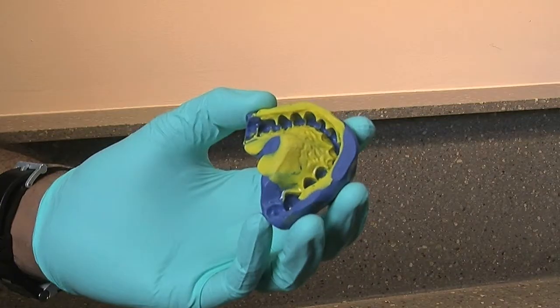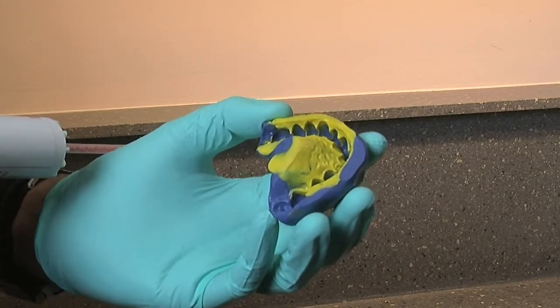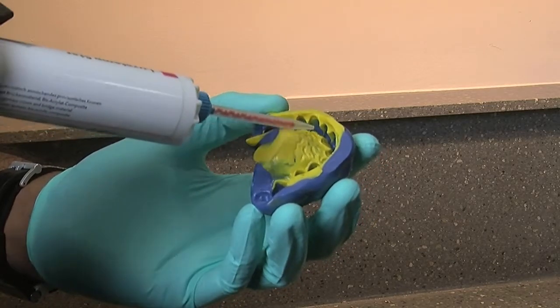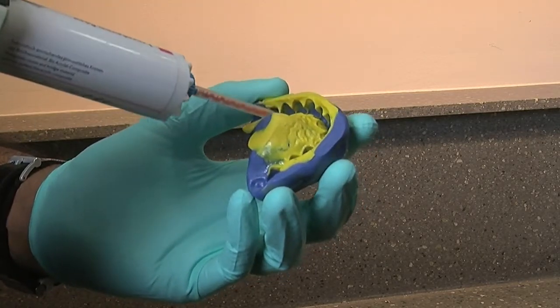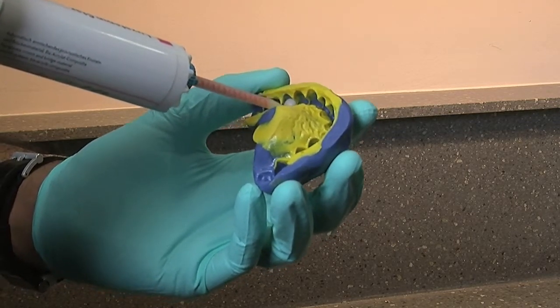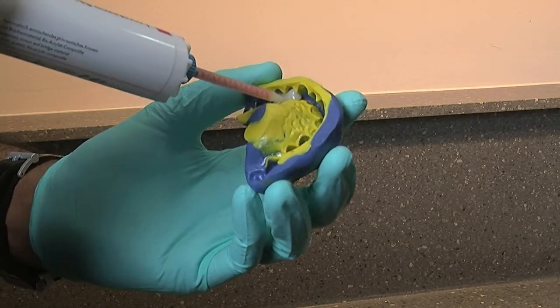Okay, let's go. So I'm just going to demonstrate the introduction of the Luxatemp Star material into the putty index as we do the temporaries, the trial smile. So I'm going to start, this is the upper left 5 area, I'm going to go all the way to the upper right 4, and the important thing to do this is reasonably fast. I normally time this, so I get it done within about 2.5 minutes from start to finish to set in the mouth. So I'll start syringing there and keep going around, keeping the tip in the material.